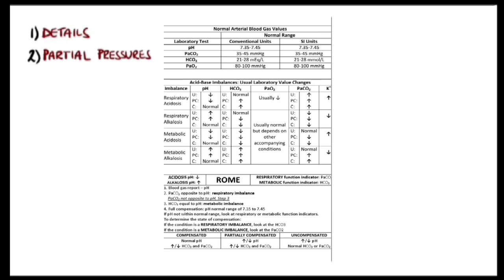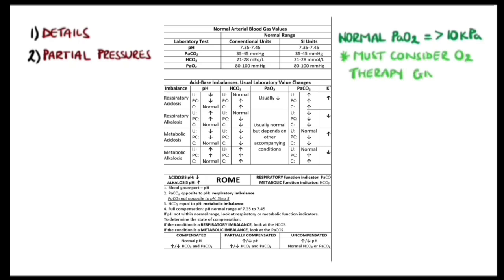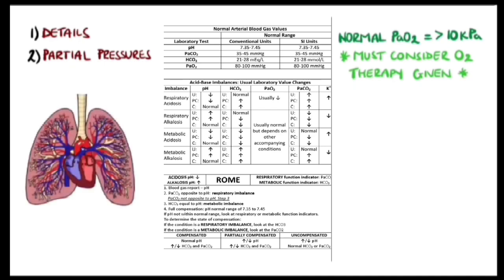If the PO2 is below 8 kilopascals, this is considered respiratory failure, of which there are 2 main types. Type 1, where oxygen levels are low, but carbon dioxide levels are not elevated, or type 2 respiratory failure, where carbon dioxide levels are high, called hypercapnia. The normal range is roughly 4.5 to 6 kilopascals. An easy way to remember this is type 2 has 2 gases affected.